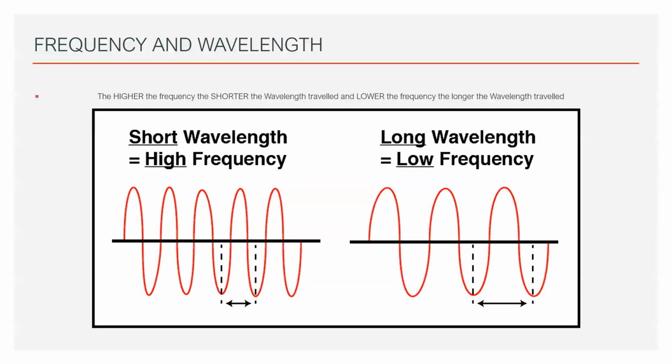Now, as I've described to you, it's very important that you understand the concept of high frequency short wavelength and low frequency long wavelength. And to explain that, I'm just going to try and see if I can do a little bit of annotation.